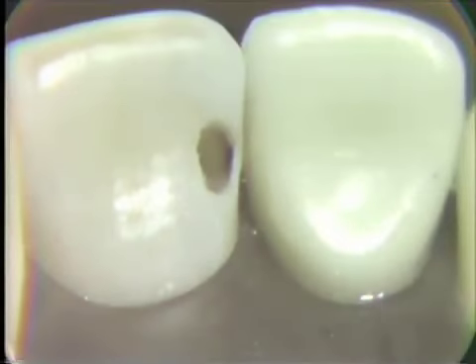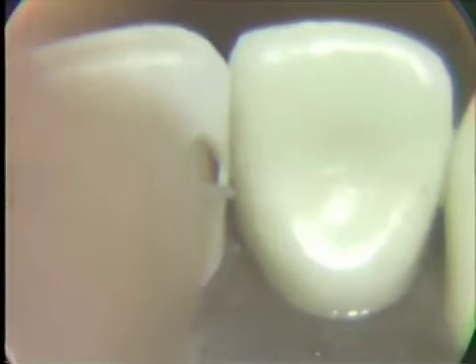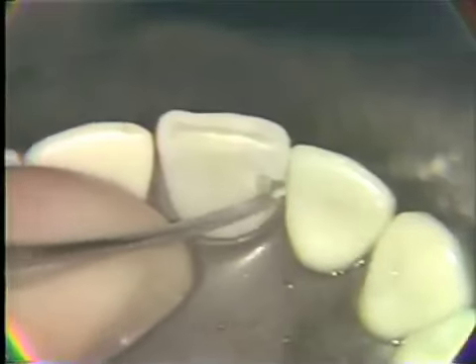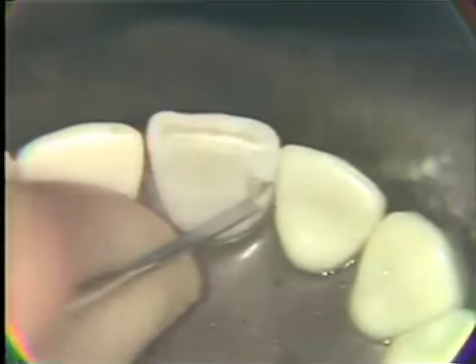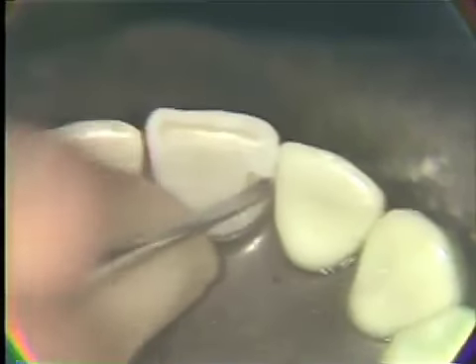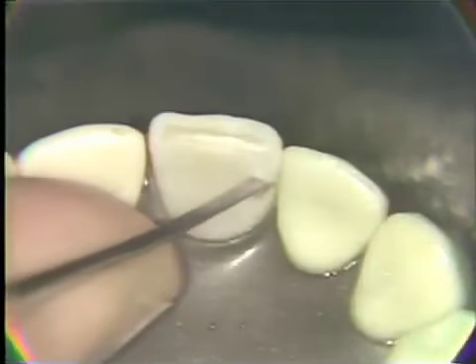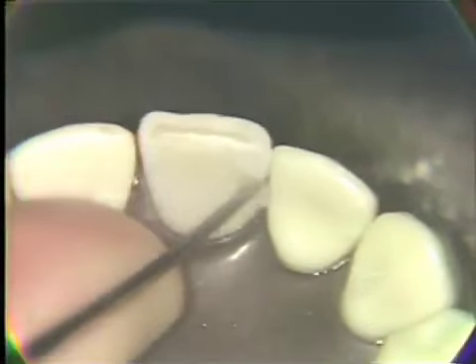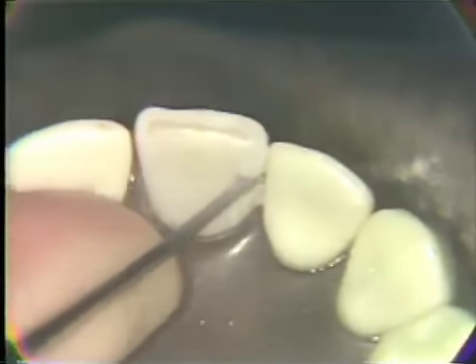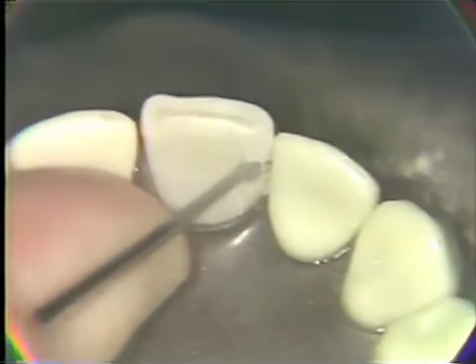At this point, we might begin to remove the protecting area from the adjacent tooth with a hand instrument using a Wedelstaedt chisel to initiate this in the cervical area. And then at the incisal area, a similar removal of the unsupported enamel. As I'm doing this, I'm seeing here again a little greater extension of the caries, both labially and incisally, in the enamel position.